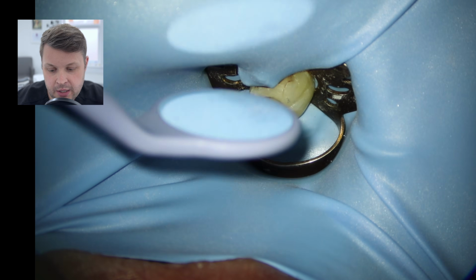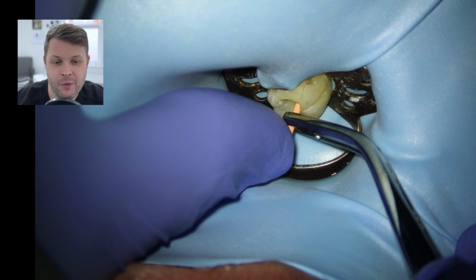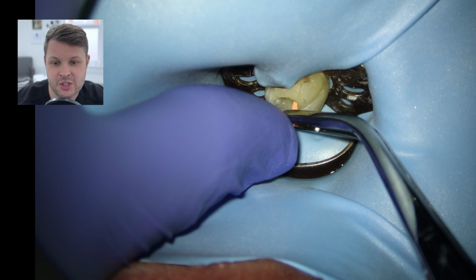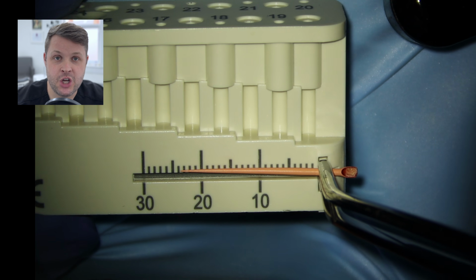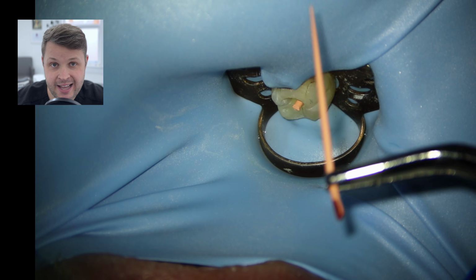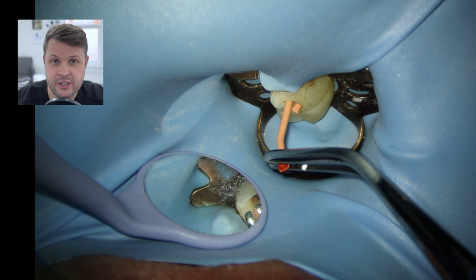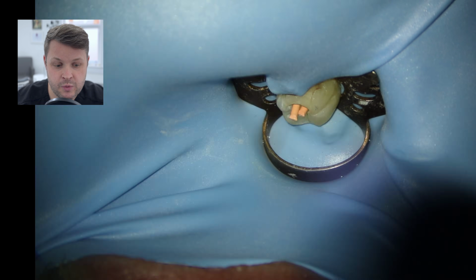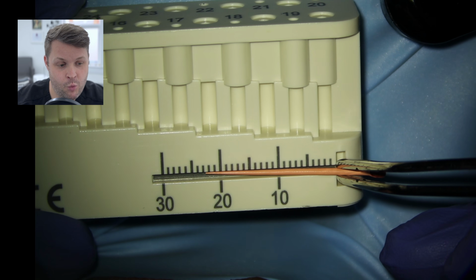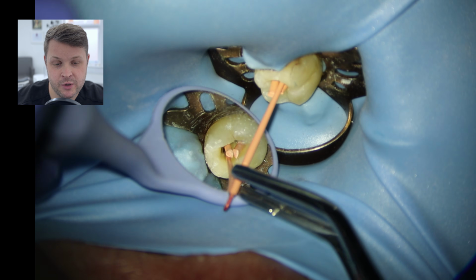This is what I say to patients is our dress rehearsal for the root canal. This is where we place our GP cones to the point where we're going to fit them with sealer. So every single time, I make a note of the working length of the canal we're working with, then I measure the GP point and use interlocking tweezers to snip to this point. Then I push the GP down to the length and see at what point the cone's been crimped, to see if that corresponds with the correct working length.